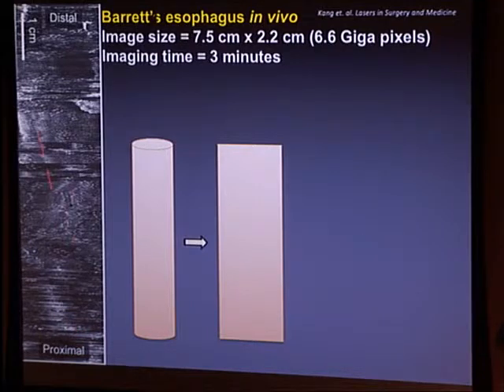The way to look at this data is that the esophagus is a tube, and let's say you cut on the side and then unwrap it, and that's what you're looking at here.